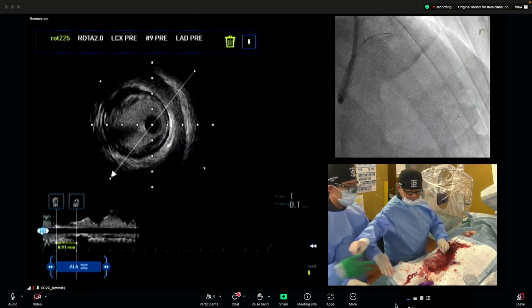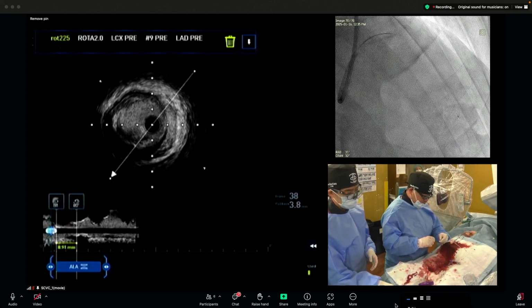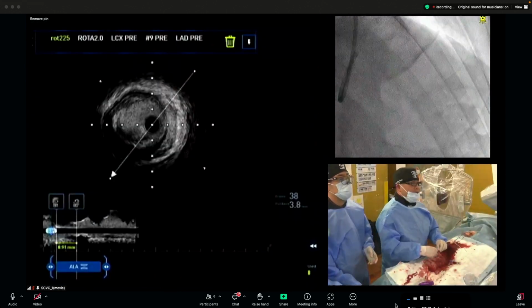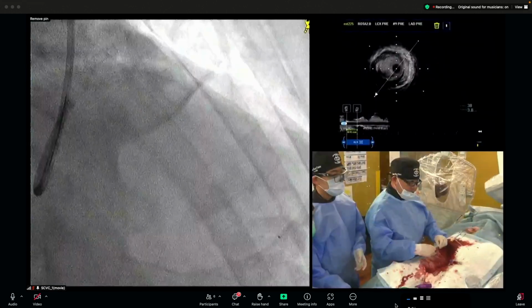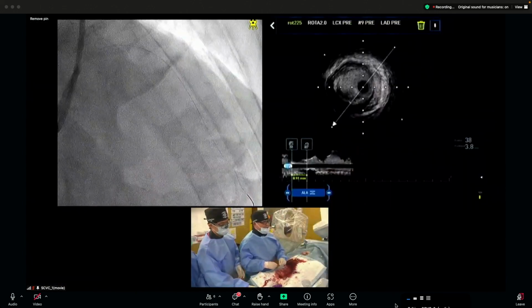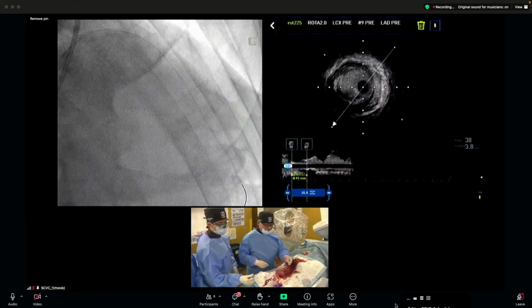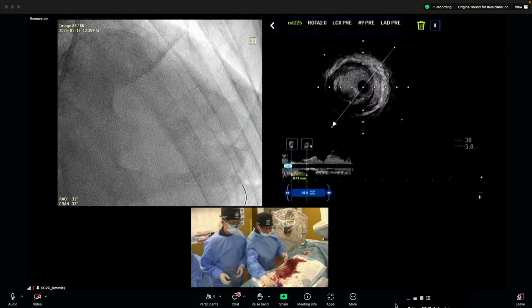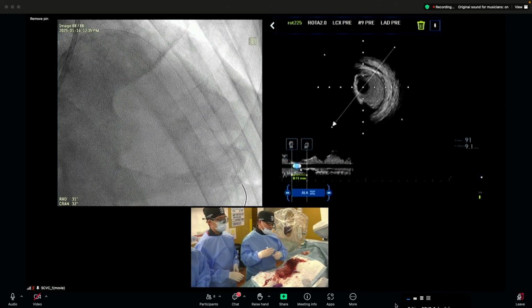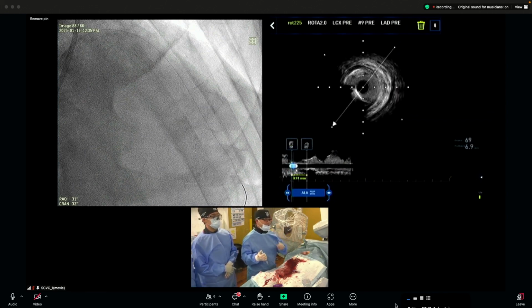Dr. Kashima, could you tell me the relationship between the speed and the bar size? It's a good question. Based on the physics, of course, a larger bar always gives good rotablation performance compared with a small bar when we set the same rotational speed.